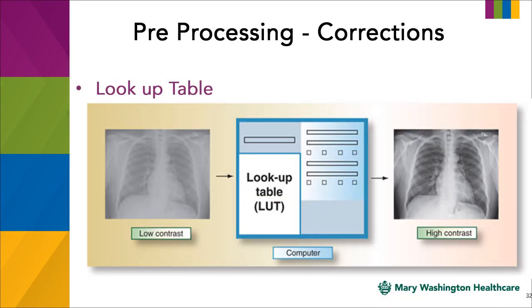The lookup table. So we go from a low contrast image, we go to the lookup table, which is in the computer, to a high contrast image. So it's going to control contrast.